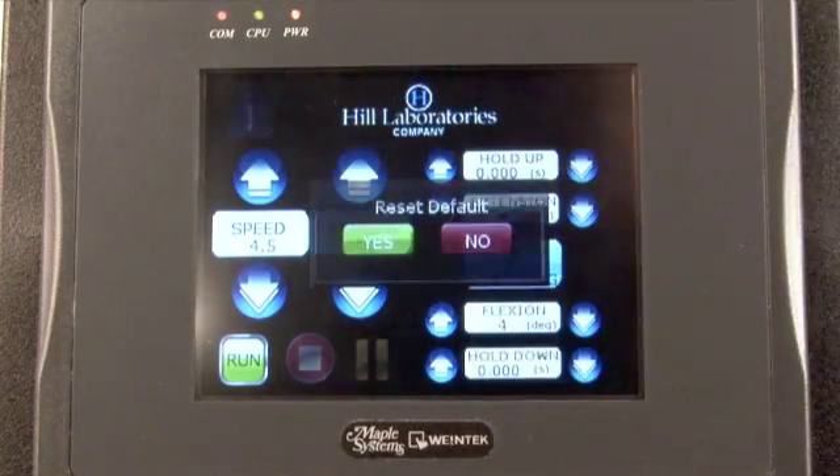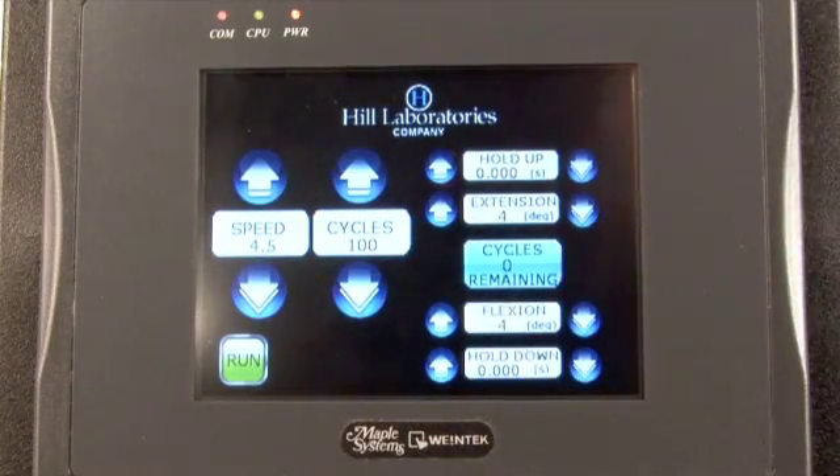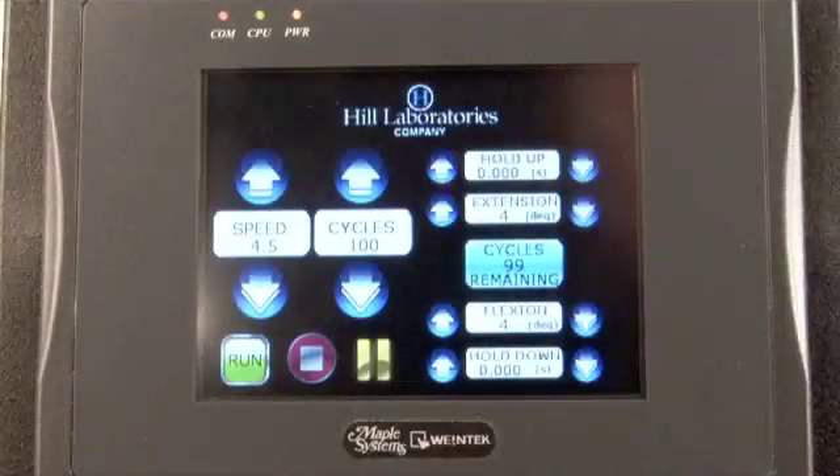The touch screen will give you the option of keeping the current treatment settings or returning to the default parameters. During a treatment, use the yellow pause button to pause at any time. Use the stop button to stop the treatment entirely.